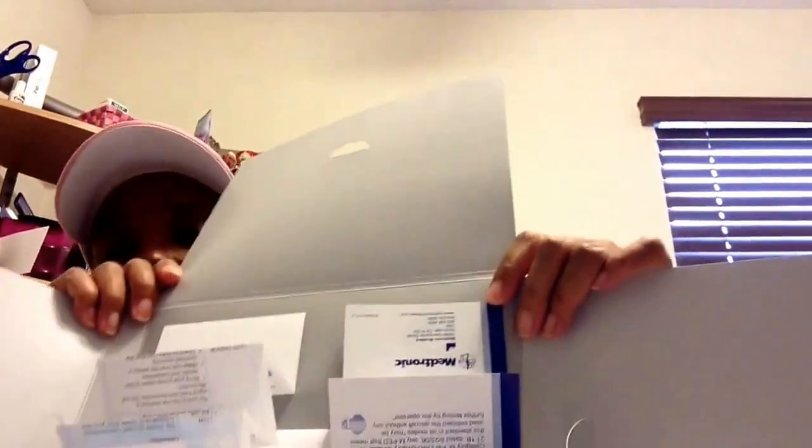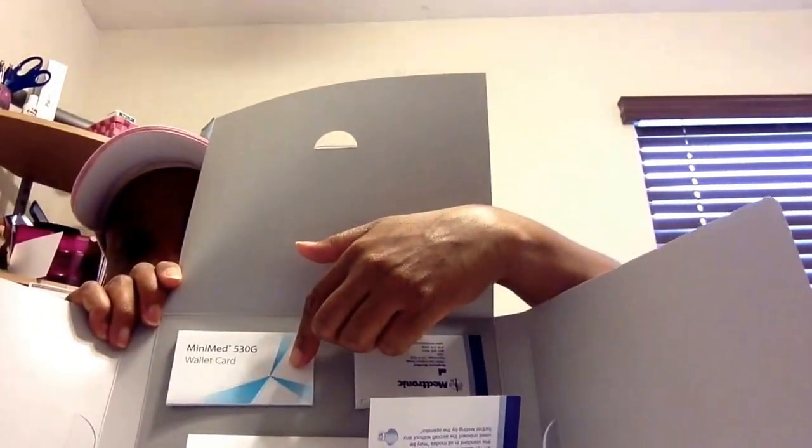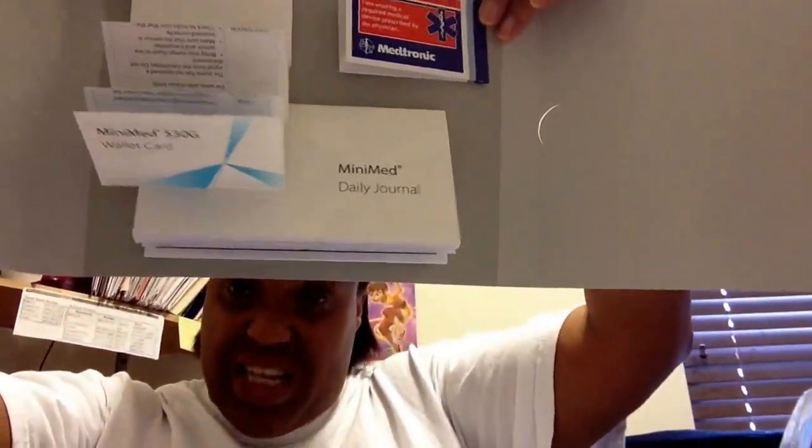This is the niftiest thing I have ever seen — I have to take it out of the box to show you because it's attached. It came with a MiniMed wallet card, so just in case you forget, it tells you how to do things. It also came with an ID card. And then it came with a daily journal, which is cool because when I start off with new pumps, I usually try to keep some type of diary that tells me what I'm doing wrong or right.